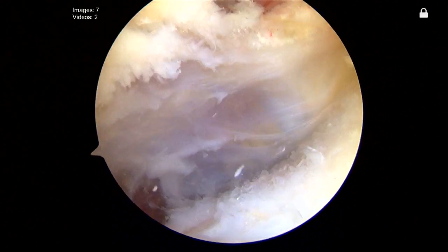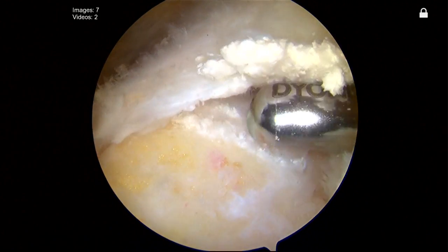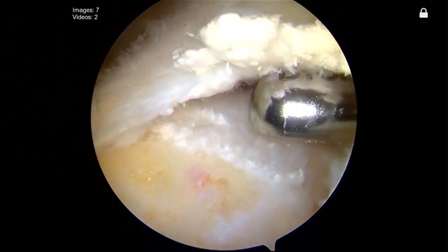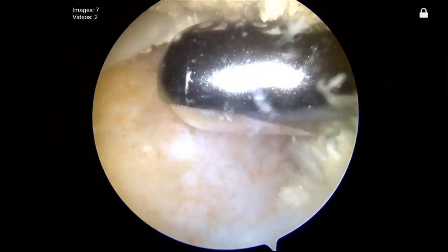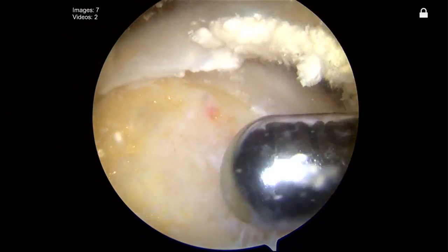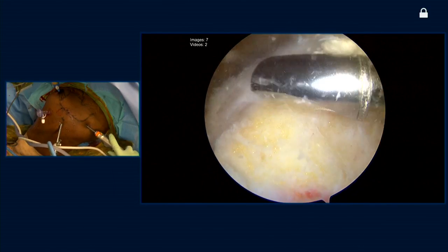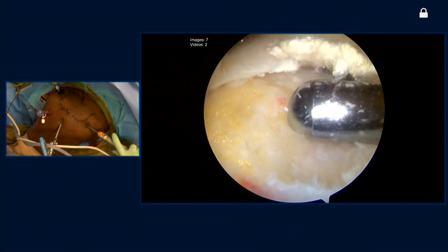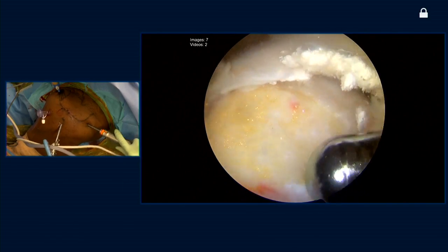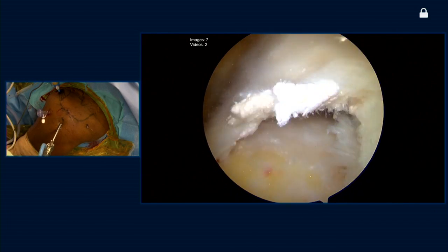Now we'll look at the tuberosity. We've already identified our cuff tear. You can see the edge of the articular surface. I'm going to do a fairly wide decortication here just to create a bleeding bed for healing. We know that the blood supply to the rotator cuff healing zone comes from the bone into the tendon. I want to spend some time here making sure I'm doing just a light decortication, creating this nice yellow bleeding bone. I don't want to take away too much bone and destabilize cortical fixation of my anchors, but I certainly want to create a bleeding rim. We will also use a microfracture-type device to further accomplish that.